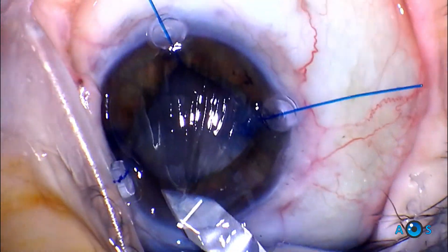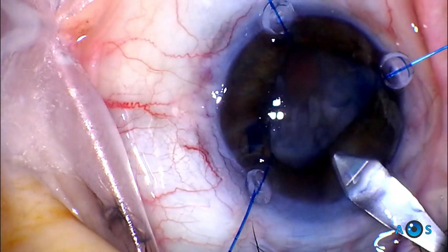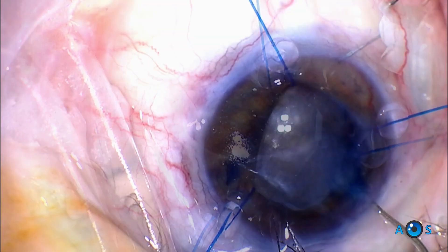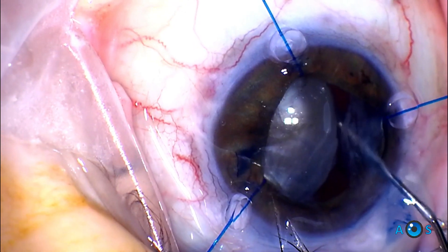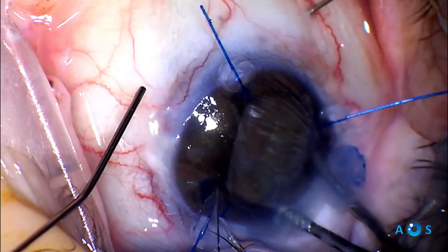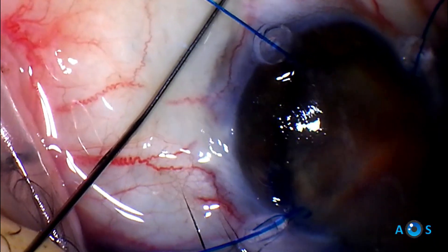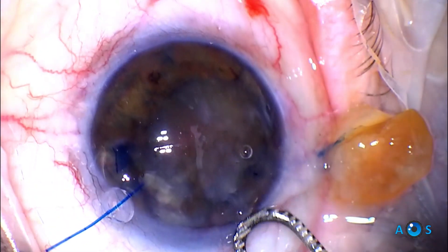The corneal incision is enlarged to about one-third of its diameter. There is a risk that this very dense cataract falls to the posterior segment, so to aid the subsequent maneuvers, a bent 25G needle is injected 4 mm from the limbus to act as a scaffold supporting the posterior pole of the cataract. OVD is used to maneuver and position the cataract, then the snare loop is slid under the cataract to extract it. Two attempts are required but the dense caramel-brown nucleus is successfully and completely extracted.